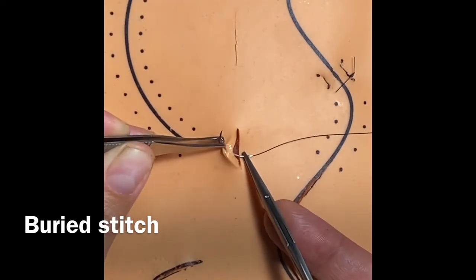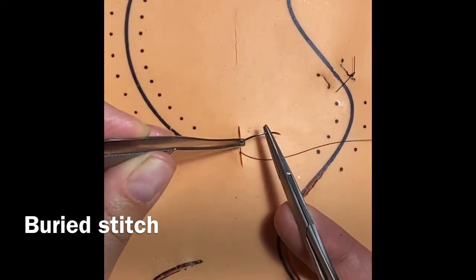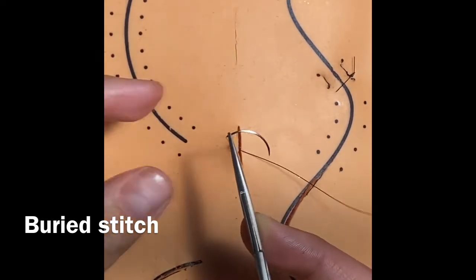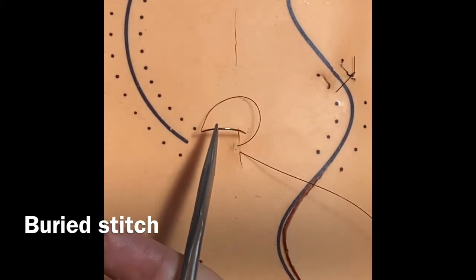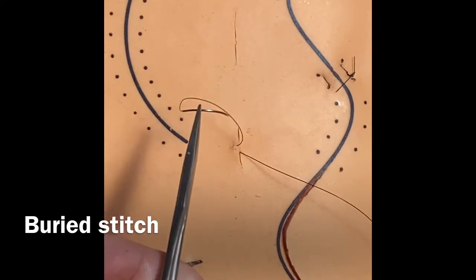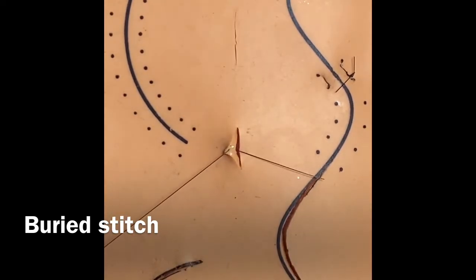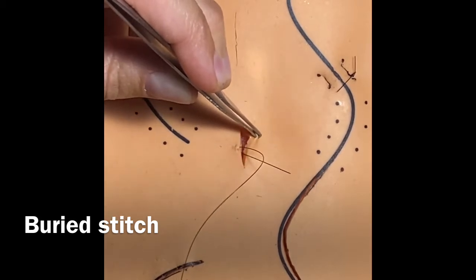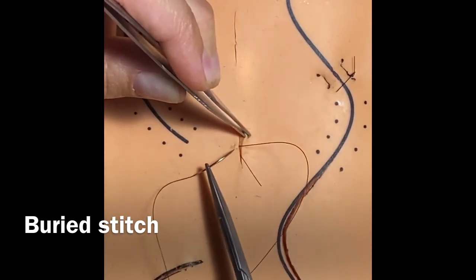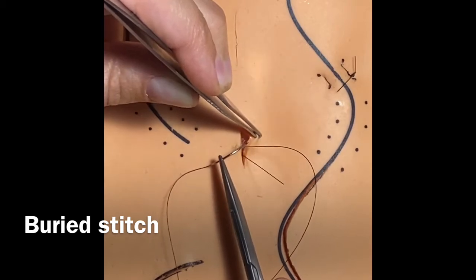The easiest way right here is to just go ahead and pull your needle through and reload it at the same time. So you're going to want your needle back loaded, so backwards and upside down. Okay, so you can pull your tail through if you like now, or you can do it at the end. And then we're going to evert the skin edge on the opposite side, and we're going to go exactly across from where we came out with our superficial bite over here on the other side.